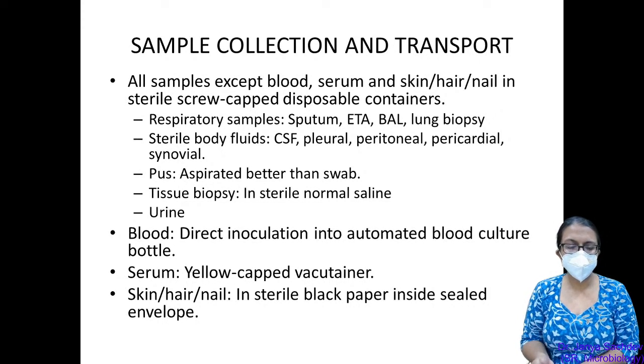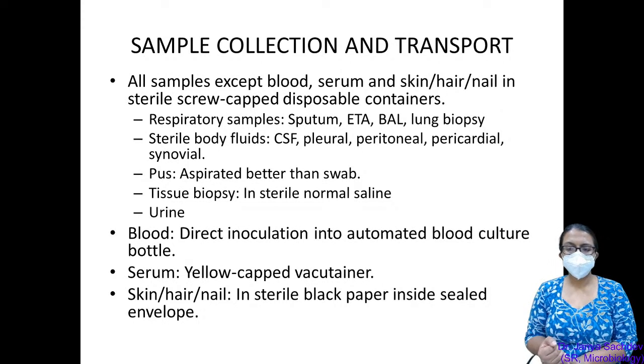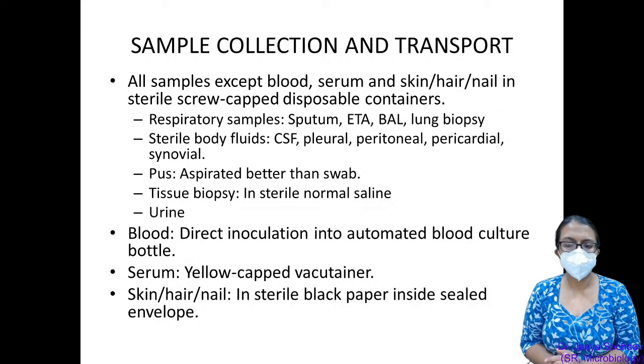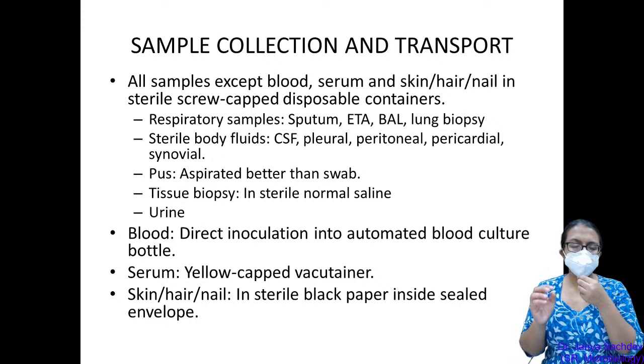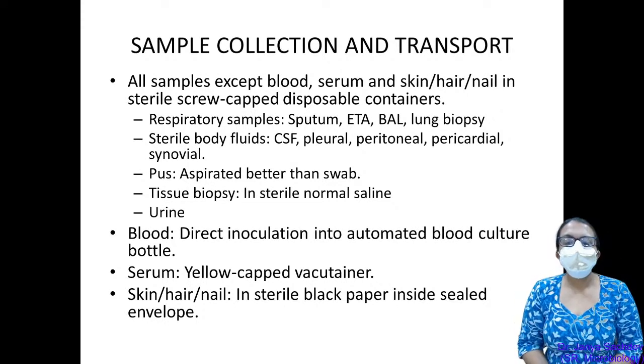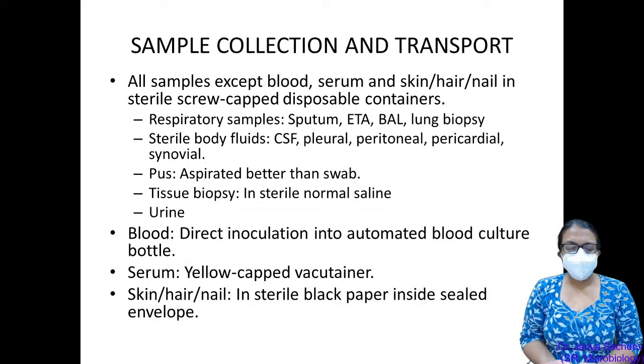I'll be showing you a picture. Blood for fungal culture. We are presently doing automated fungal culture. Most places are switching to automated fungal culture for blood and for bacteriology also. So the automated blood culture bottles which are available are separate for bacteriology and separate for fungal blood culture.